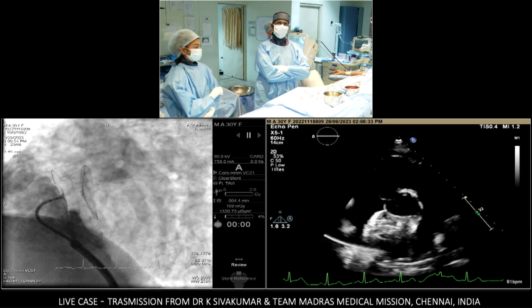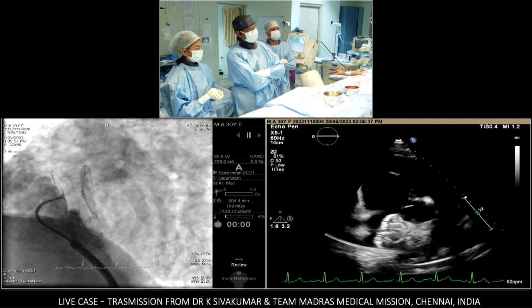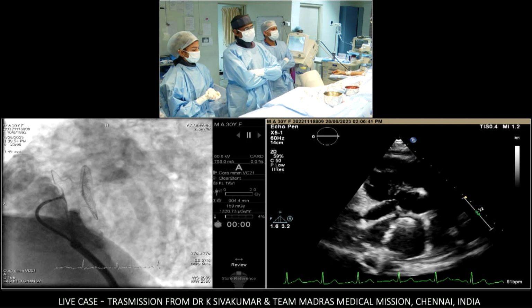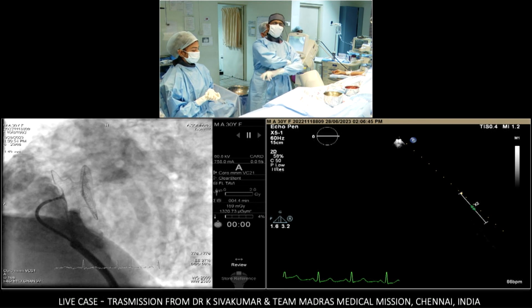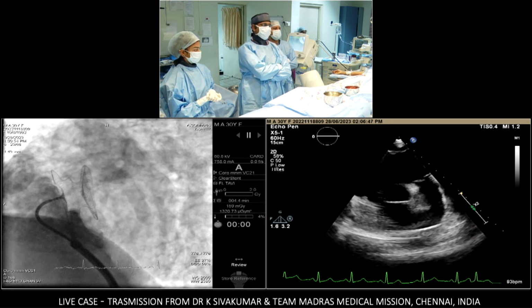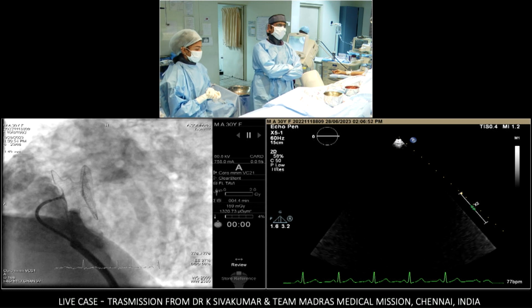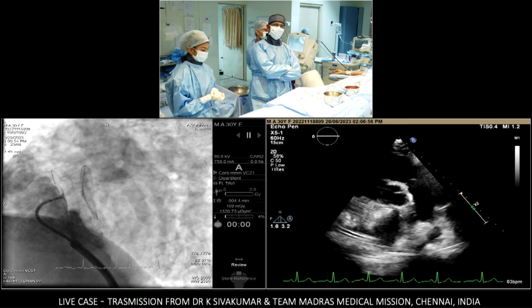I am equally as informed as you because this is the first time I'm using this device and seeing this device. As I mentioned to you, the proposer of this device has mentioned that since there is a differential waist that can go for 3 diameters, 14, 16 and 18, a single device probably will be enough for covering 14 to 18 millimeter defects.